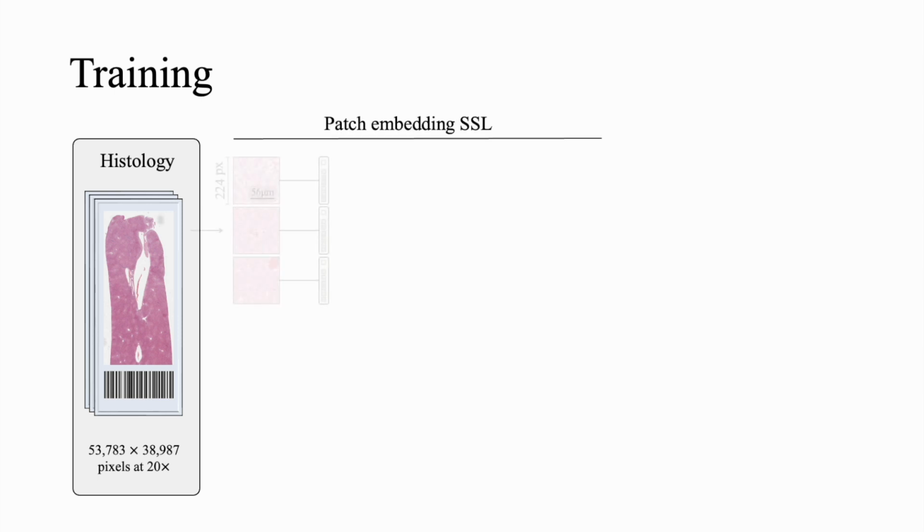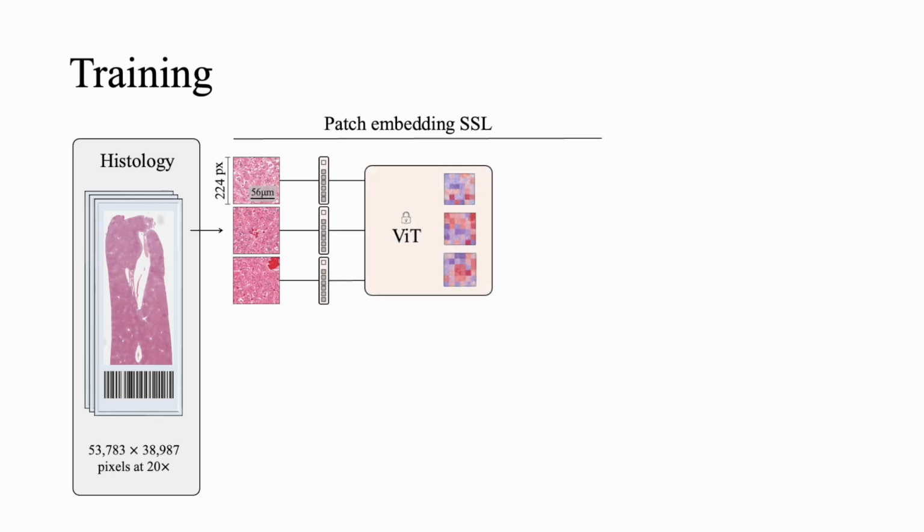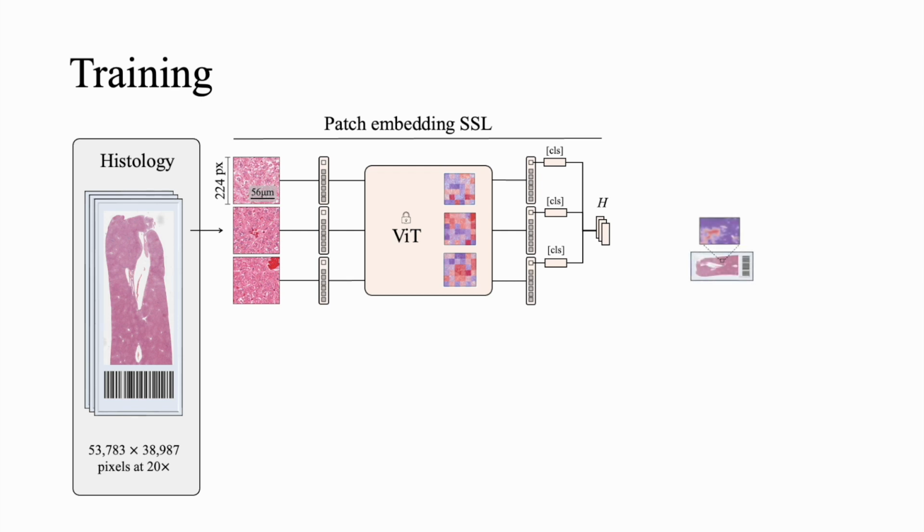Since they are gigapixel-sized images, we want to subdivide them into smaller patches. And we can tokenize these patches and feed them to a vision transformer, which basically serves as our feature extractor. We can exchange it, since it's frozen and not trained during TANGLE, and we pre-trained our own model. But this is not really what we want to do, since we now have a pooling of the patch embeddings, but they are not really contextualized.